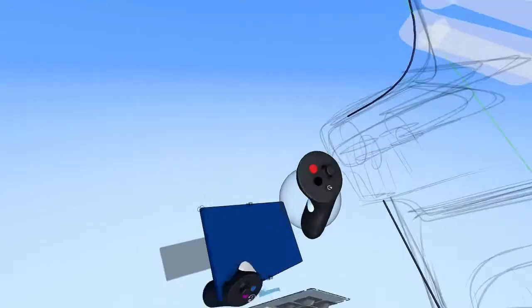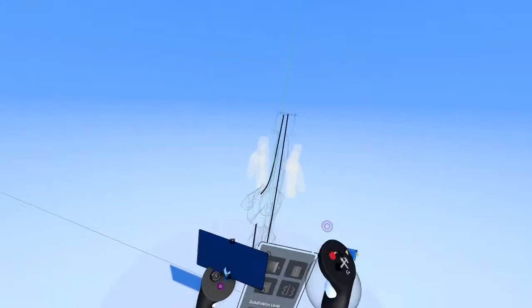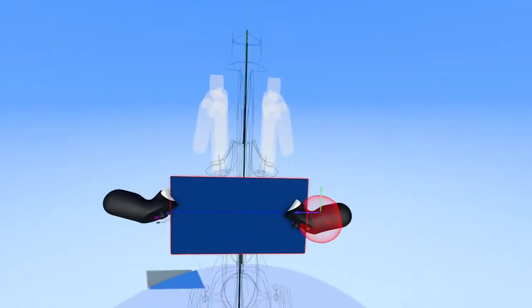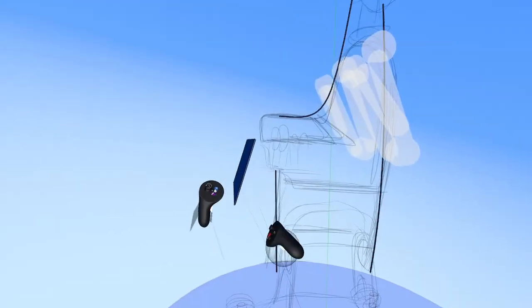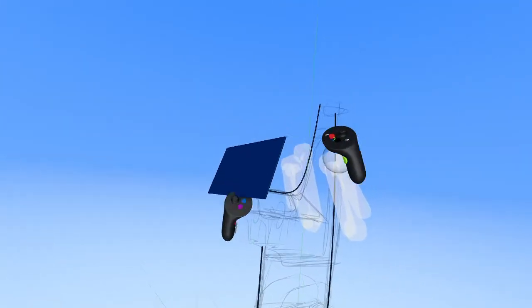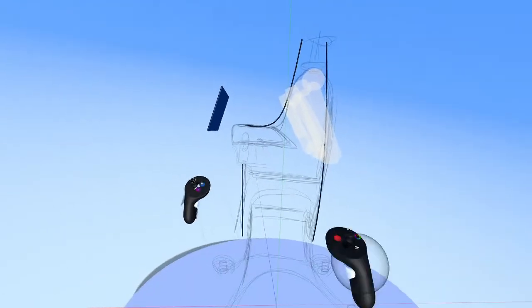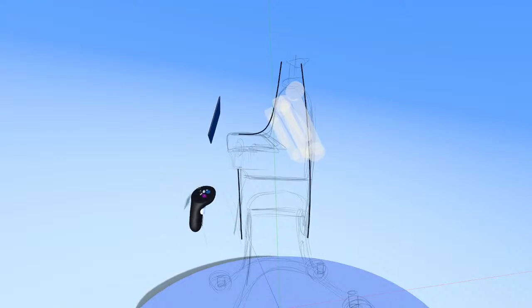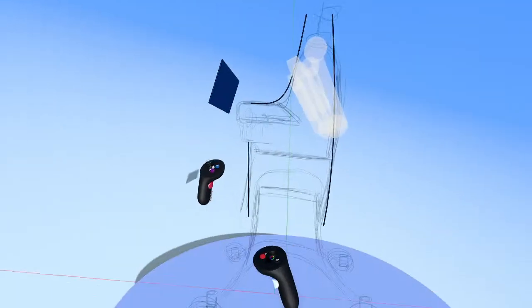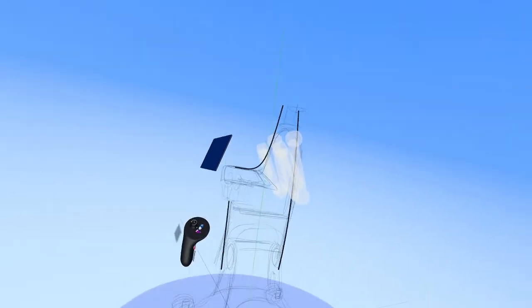So let's shape this to be a good screen size here. Let's make it a little smaller. It's not going to be our main visual, right? Because that would probably happen on an external screen somewhere. This is going to be something that applies just to the robot. And we'll hang it somewhere low like this. And yeah, actually now that we've placed it, we can even provide a track here so that this screen can move up and down. So it could probably even lift up that high, and then we'll give it a pivot point here as well. This is actually a really good product to figure out in Gravity Sketch because there's so many pivot points and a lot of complexity to it. Maybe not this one, but the actual product.